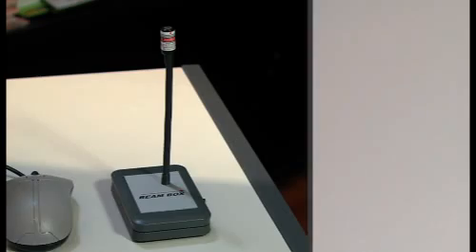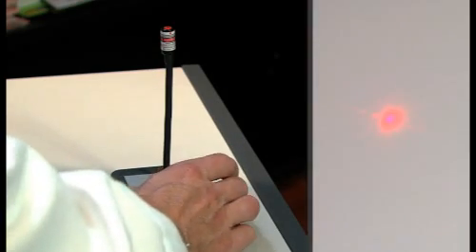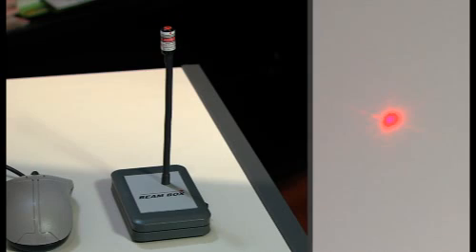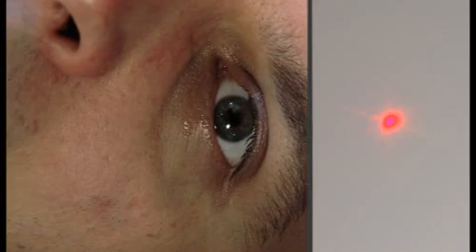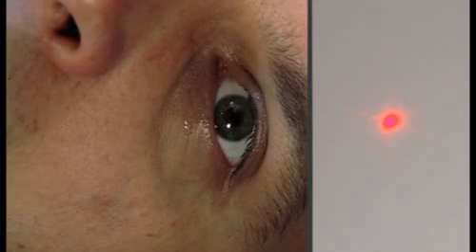The beam box is an extremely useful aid. The operator asks the patient to stare at the red spot on the ceiling using the eye opposite to the one being examined.